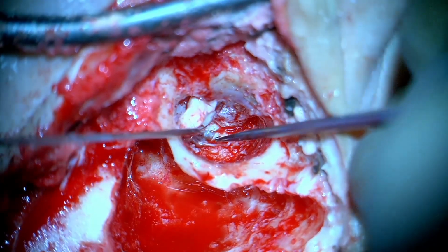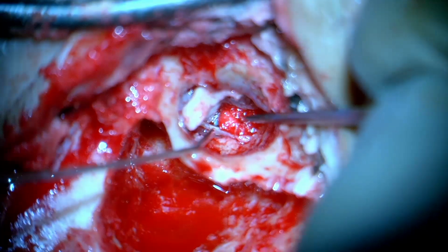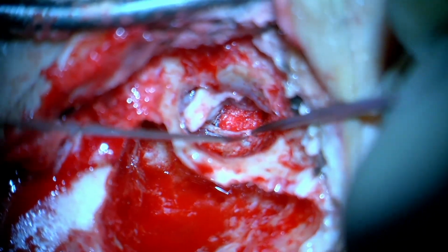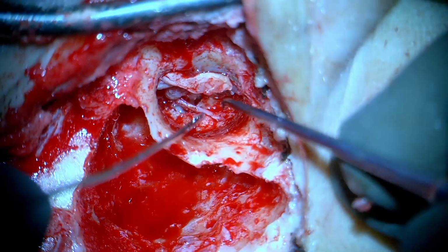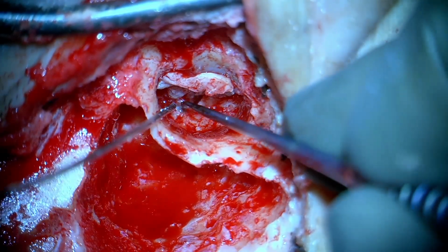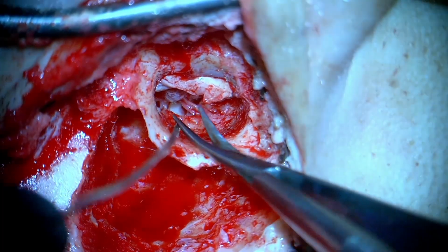You see, that is us entering the middle ear, and the middle ear seems to be clean, and you can already see the chorda tympani. See here, that is the chorda tympani, and you know where the chorda tympani ends. That would be your approximate location of the facial nerve, assuming that the facial nerve would be just a few millimeters behind the chorda tympani. You can already see the approximate chordofacial angle from anteriorly on the canal side, something that you normally see during the posterior tympanotomy from the posterior side.